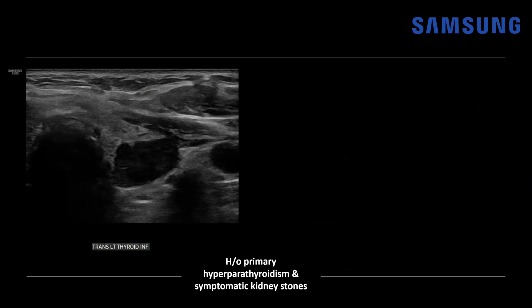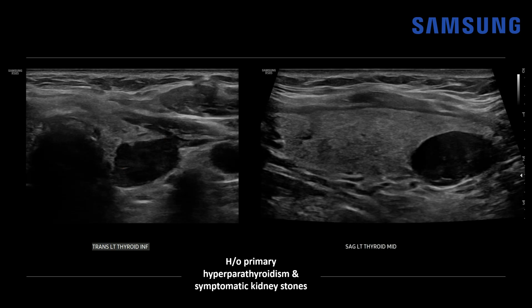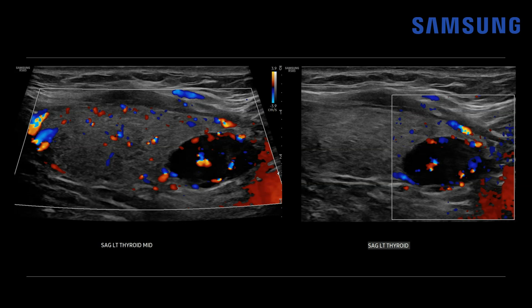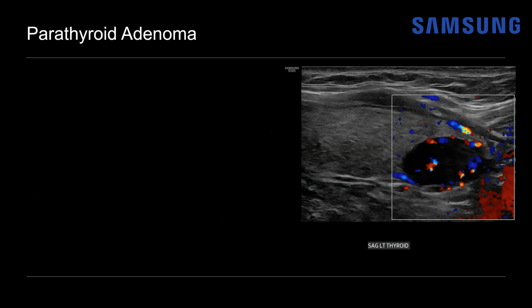Let's look at a case. This was a male in his 60s presenting with a history of primary hyperparathyroidism and symptomatic kidney stones. Here we're looking at a focused view of the left thyroid lobe — there's the trachea, here's the left thyroid, and then we have this ovoid hypoechoic solid-appearing nodule. You might initially think this could be a thyroid nodule. When we turn sagittally, we can see that it is oriented in long axis with the gland longitudinally, and there's a thin echogenic line separating it from the gland. It measures about two centimeters. When we add color Doppler imaging, we see increased flow — it is a bit hyperemic relative to the adjacent gland.